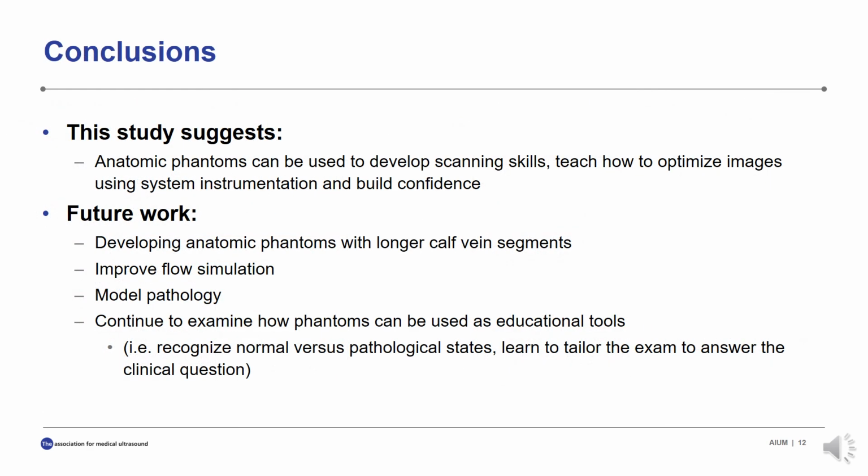In conclusion, this study suggests that anatomic phantoms can be used to develop scanning skills, teach how to optimize images using system instrumentation, and build confidence in beginning learners. Future work will be to develop anatomic phantoms with longer calf vein segments, improve flow simulation, and model pathology.